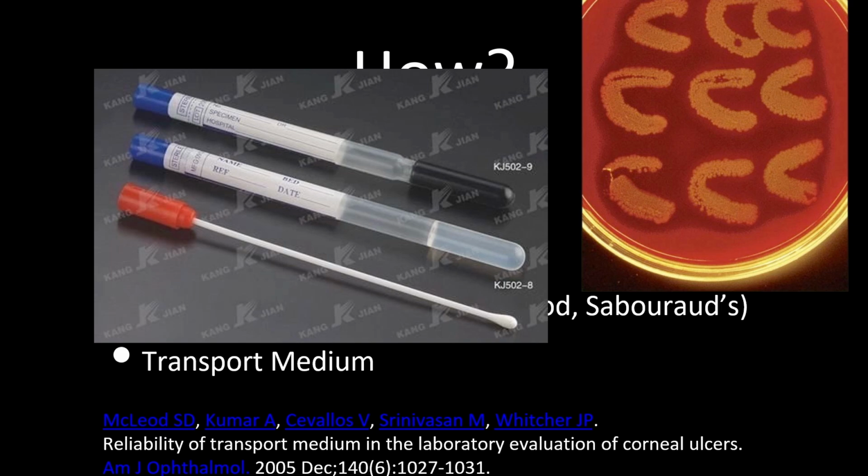I noticed you emphasized the edges of the ulcer. That's where we're going to find most of that pathogen. Usually, yes, pathogen. If you look at the previous ulcer, the chances of it being thin are much higher in the center than the periphery of the ulcer. Okay.